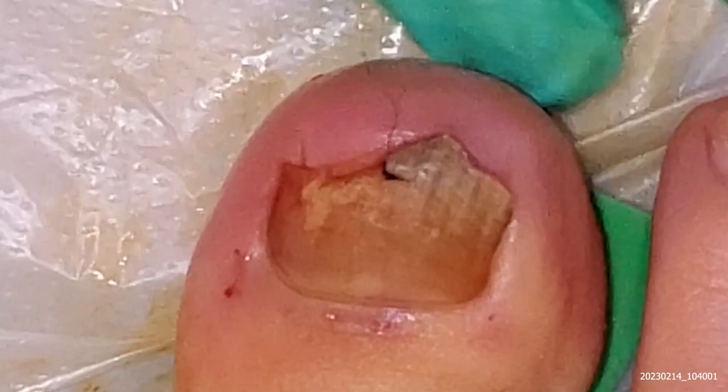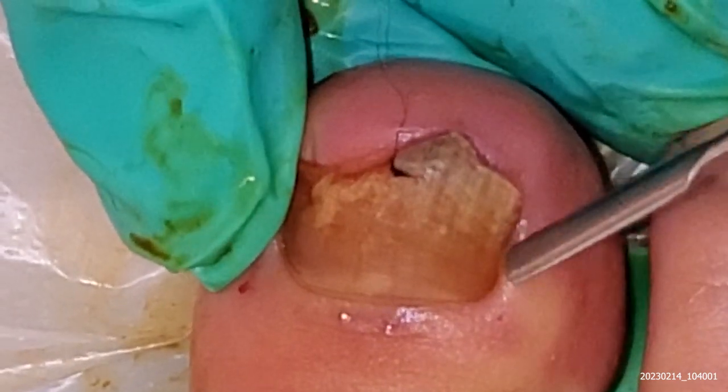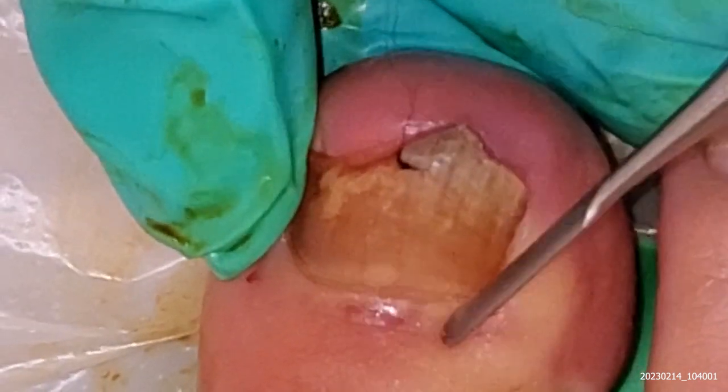Hello everybody, it's me Miss Foot Fixer. We have this lovely patient here that we've been treating for a while, and this toenail is so stubborn that it doesn't want to get better, so we are removing it.